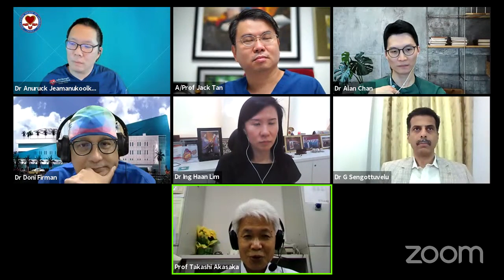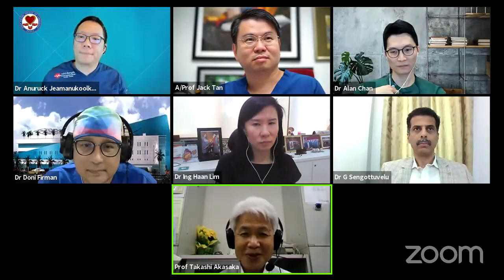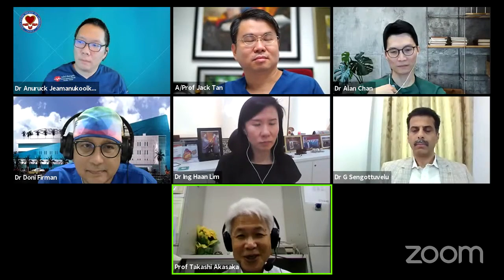We try to use an 8 French guiding system from the first. It depends on the case, right? So sometimes we succeed, sometimes we have to change the system from the result.